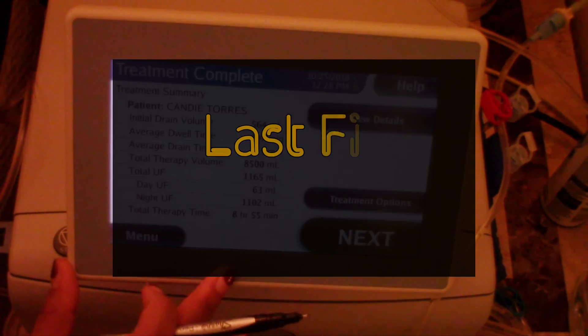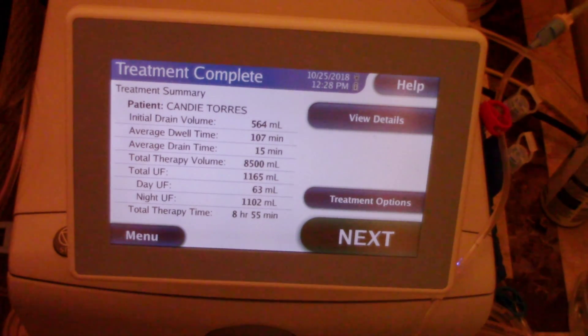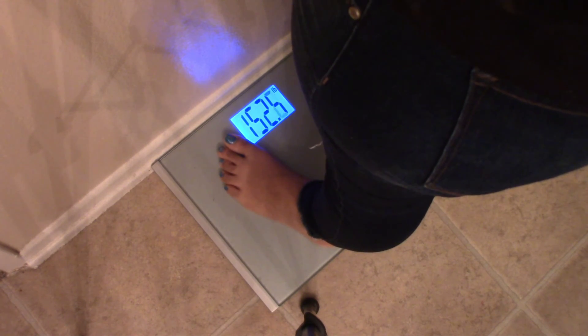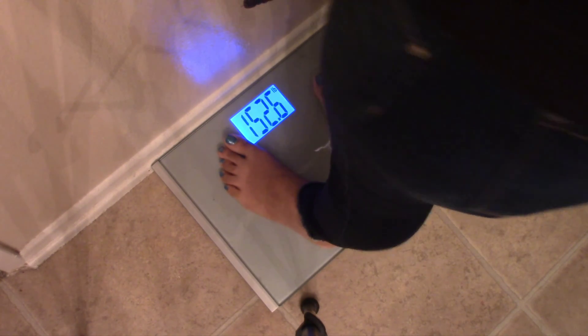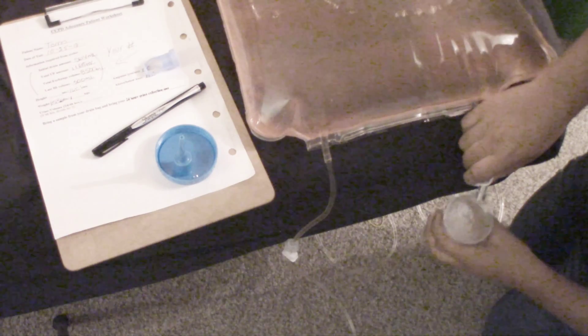My last fill volume isn't on the screen, but I know I'm left with 500 every morning, so I'll write 500 milliliters. We're also going to get our weight to put on the paper. Now, my scale overweighs me, so I'm not actually 152 — I'm more like 134. There's still water in my treatment bags and it can't be drained into the drain bag until after you take your sample out. I have my sample cup — there's a sticker on top warning that there's a needle inside, so just be careful.